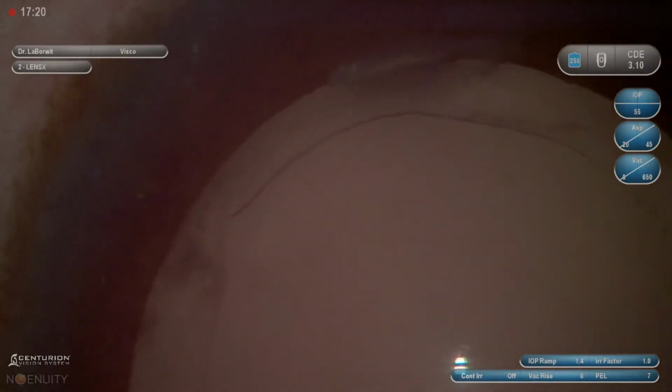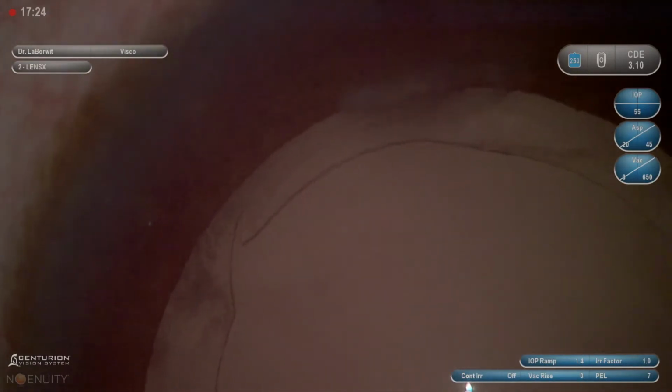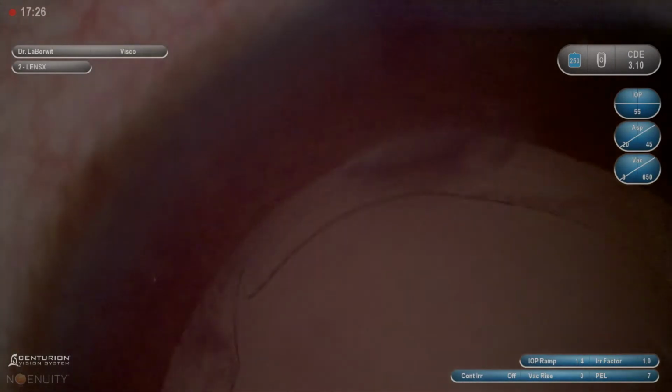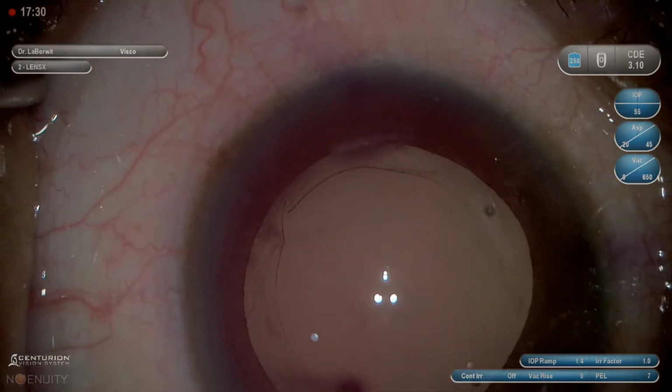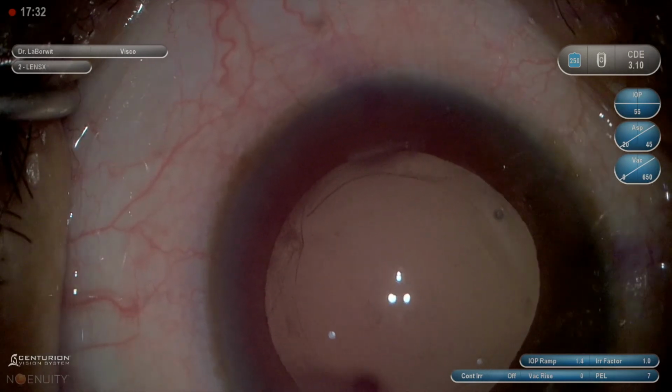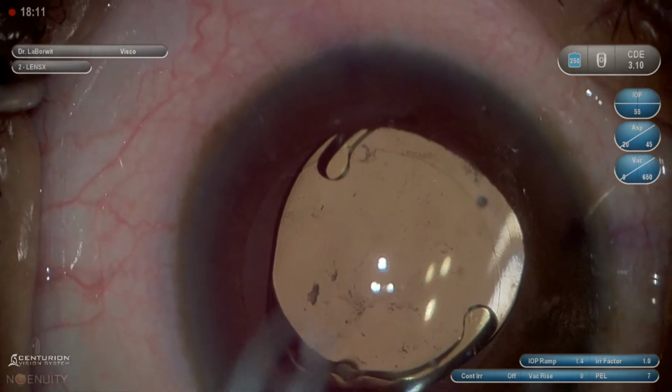Here's a picture after the lens is removed, great red reflex showing that indeed I did come inside as I went counterclockwise and did not fully connect. So there is a little bit of an incomplete continuous capsulotomy.